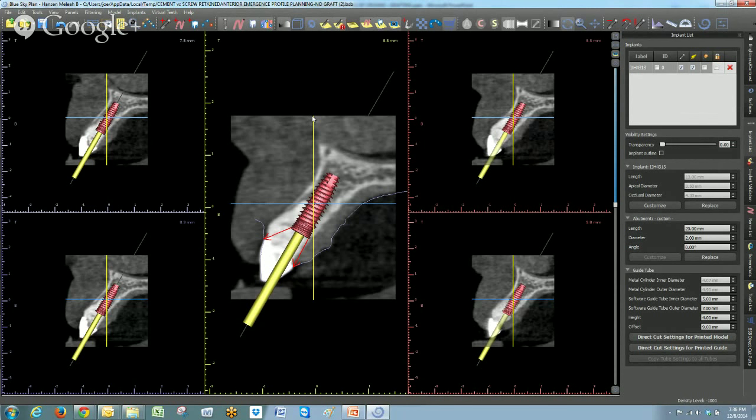Okay. He followed up by asking, all custom abutments can be made to allow easy cement removal. Why be concerned with cement removal? Well, I'm not. I tried to demonstrate what the literature is saying right now as far as what they have determined to be one of the main causes of implant failure. So there's a concern out there about it, and custom abutments can be designed to have the margins a half a millimeter subgingival. So there should be no reason for a cement problem.